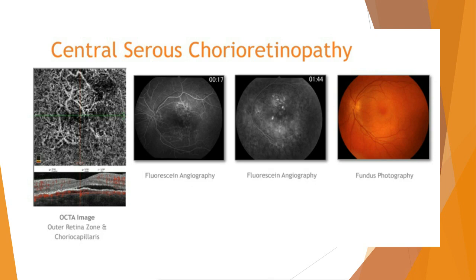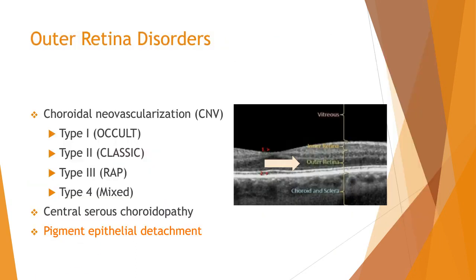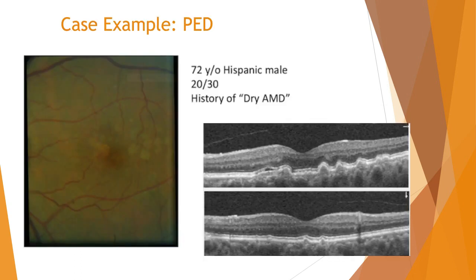And there's a highlighted view of that. The last entity is a PED. So here's a patient of mine who I've been following for a while. He was a 72-year-old Hispanic male, vision of 20/30, and I've been seeing him for a while. So when he came in complaining of changes in his vision, I looked really carefully at his fundus.